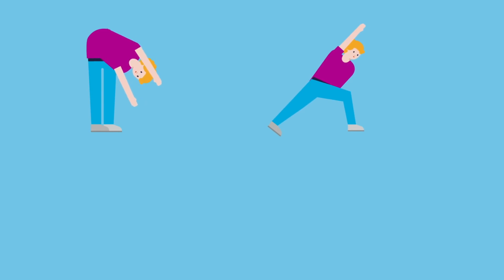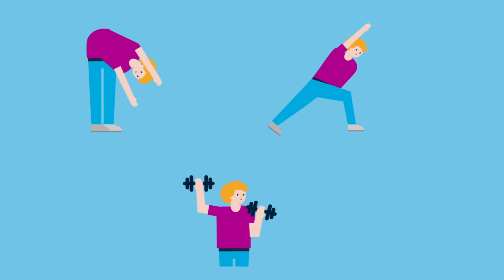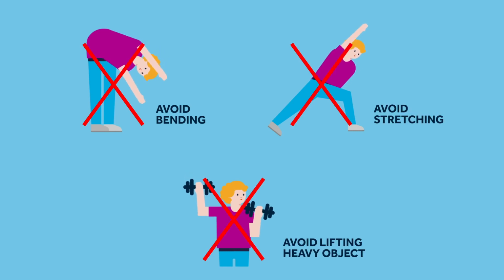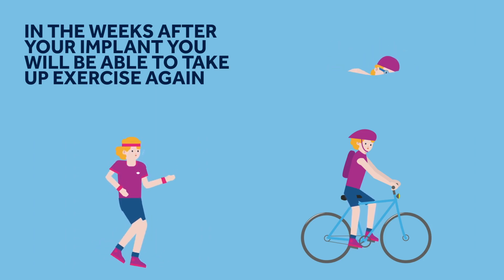For a period of 6 weeks, or whatever your clinical team have advised, it is best to avoid bending, stretching, or lifting heavy objects. Once at home, gradually increase your physical activity level as your incision heals. On your doctor's advice, you will be able to resume an active lifestyle.